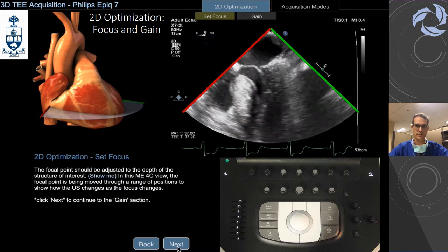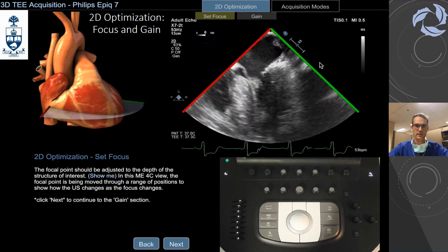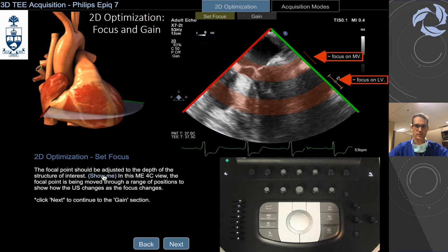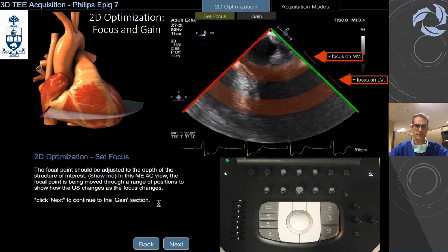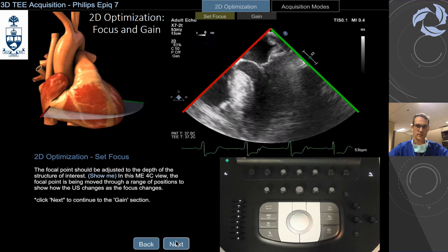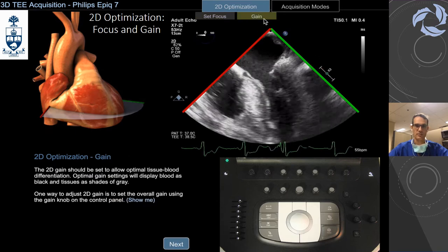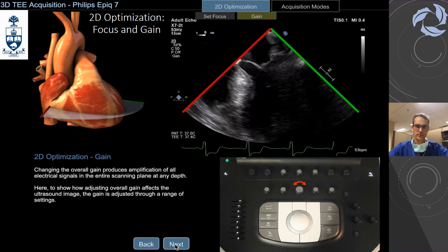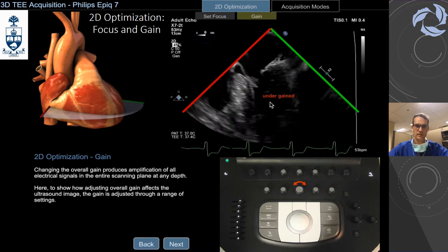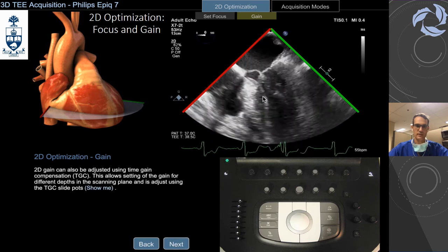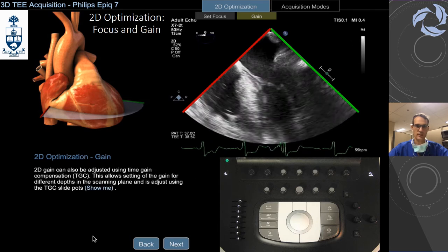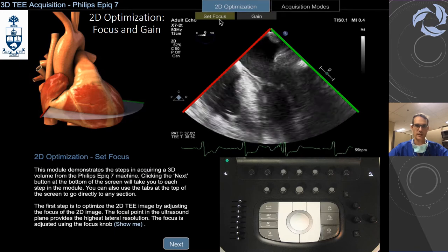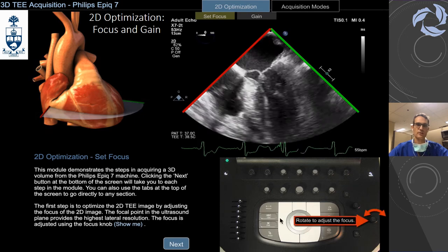We are going to select the focus, which is right here, and then you go up and down and focus on the structure that you want. In this case, the mitral valve is going to be around here. If you want the LV, you are going to focus over here to get the best image possible. Now for gain, you are going to use this knob over here, and you can rotate to the left or to the right. The recommendation is between 50 and 55 — don't over-gain, otherwise the image is not going to be good.